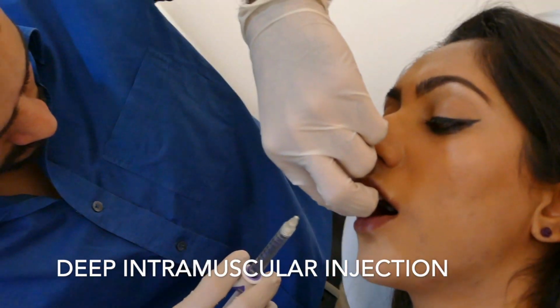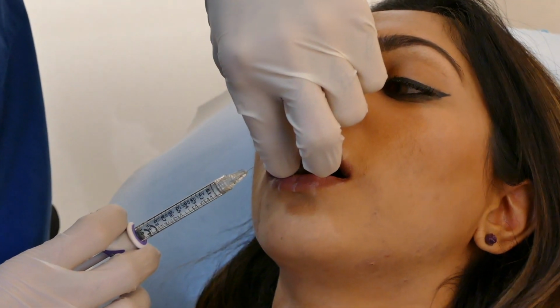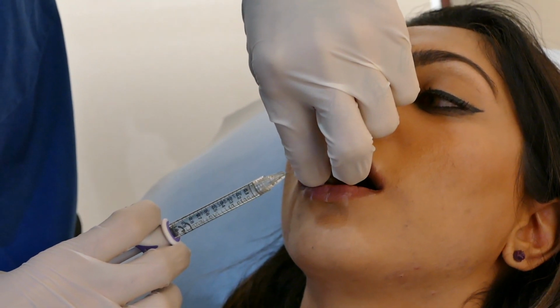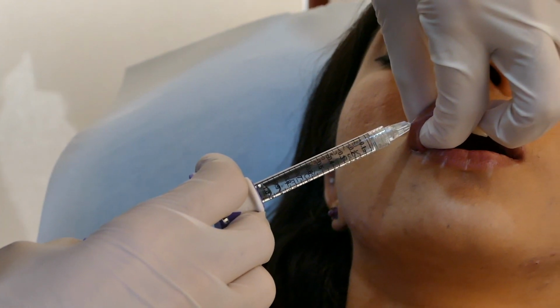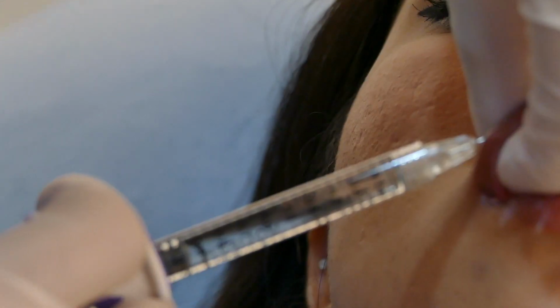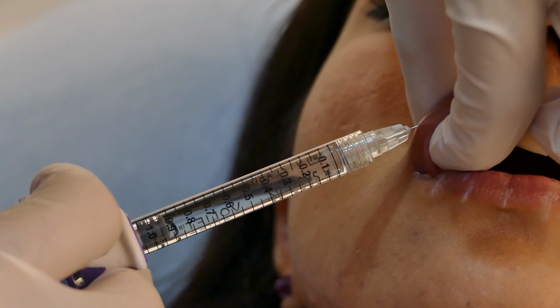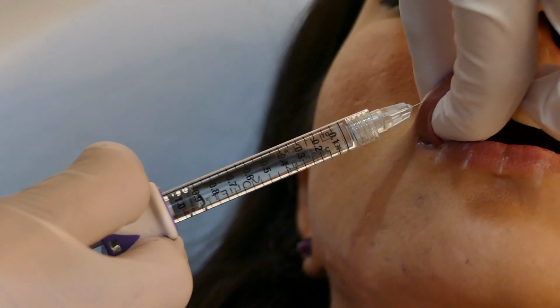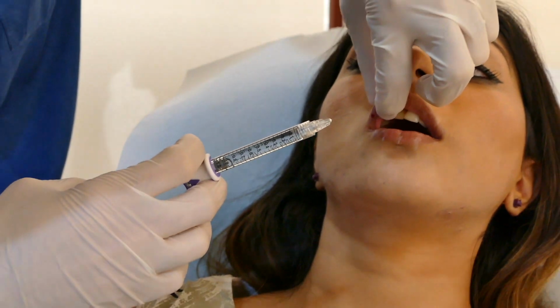This is the needle technique for injecting fillers in the lip, and here he is injecting deep in the intramuscular layer. A very gentle introduction of the needle and slow injection by withdrawing the needle out and placing small quantity of filler in the intramuscular region.